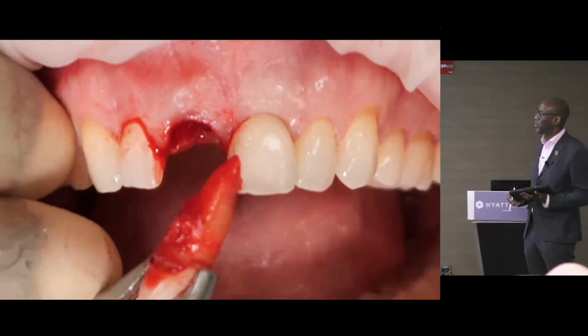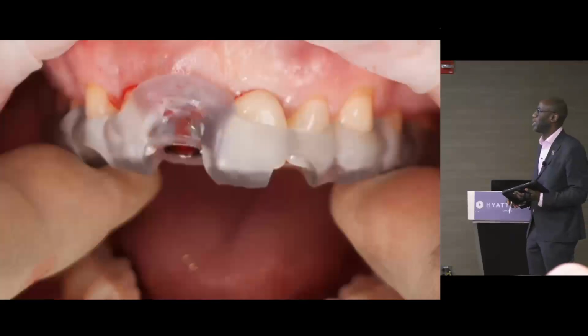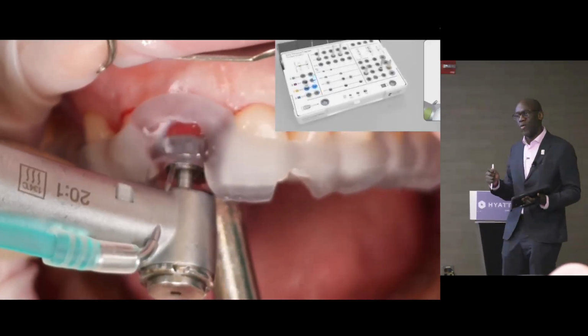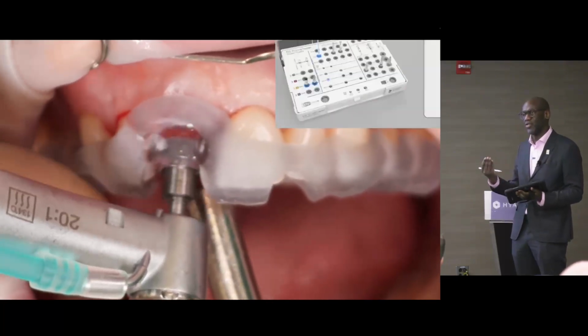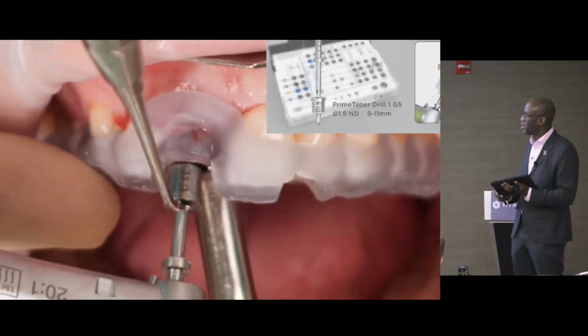And again, just a quick video showing the extraction, and from the extraction, what we do is we then go through and place the implant, and at the end of placing the implant, we have pre-planned in the software what size of tie base we need, what size of the hybrid base G we need. We also know what cut we need in the software.